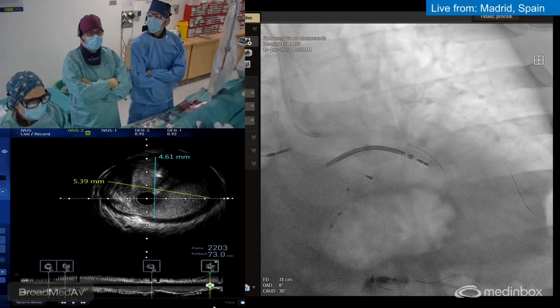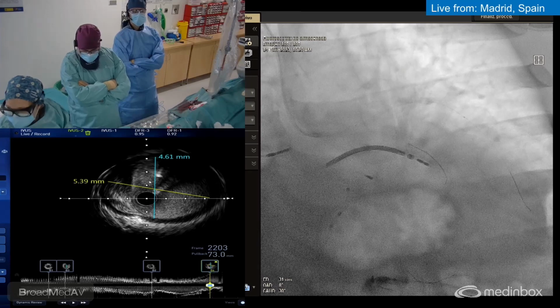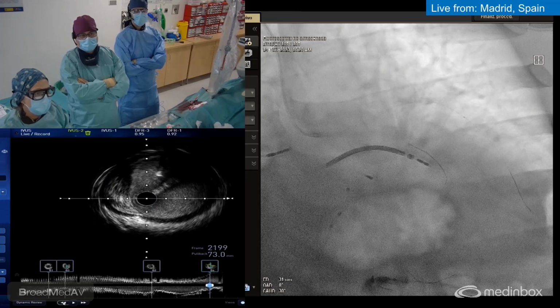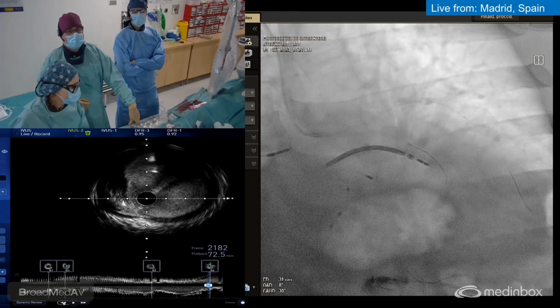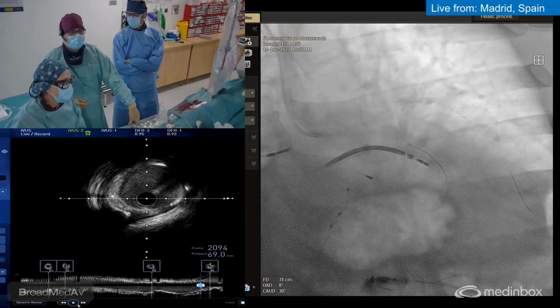Danny? No. We are doing the measures. I am still thinking that the left main is 5. Is 5. Okay, let's put a stent. So no, probably a 3.5 by 16. We got it. The stent.